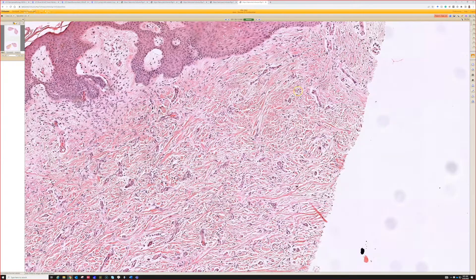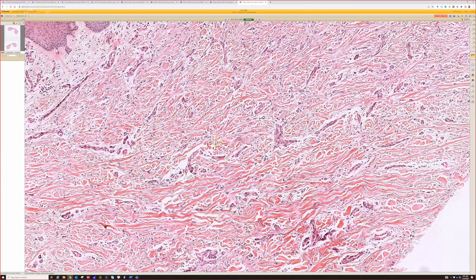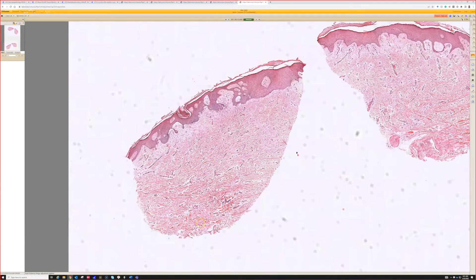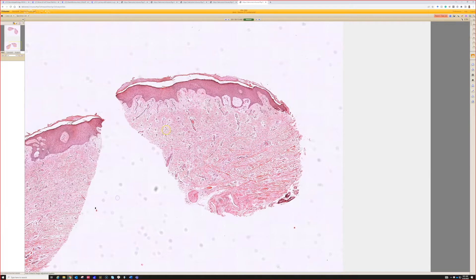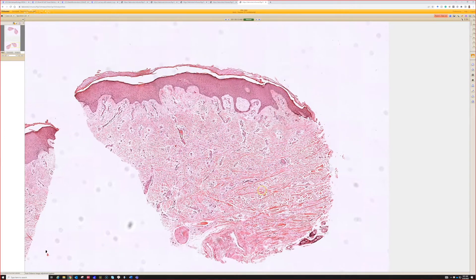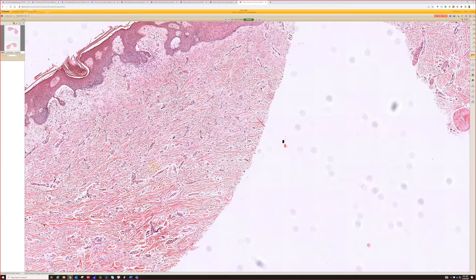We don't have any normal dermis next to it to compare, but that's helpful when you do, because at first glance — since the whole specimen has this look in the dermis — it can trick you into thinking the dermis is not the issue. That's an easy mistake to make when starting out in derm path. With an excision you can see it's very different from the surrounding tissue, but with a punch or shave where the whole dermis looks this way, it's easy to think the dermis is pink and the issue is the epidermis. Learning the dermal changes is a subtlety.